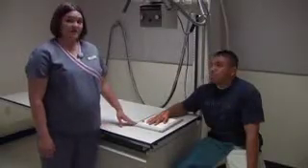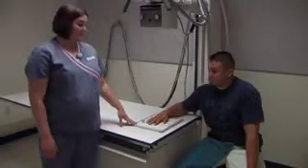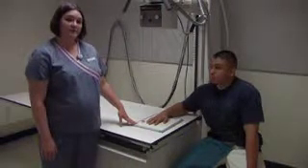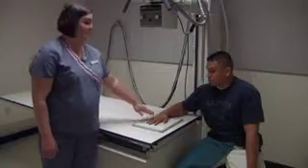From the PA projection, you go to an oblique projection. You do not position the patient by the injured part. Do not grab their hand. For an oblique projection of the hand, again, you move from below the injury. You want a 45-degree angle. So you're going to show slight superimposition of the third, fourth, and fifth metacarpals and space in between the second and third metacarpal. You can also use a radiolucent sponge if need be to get a 45-degree.